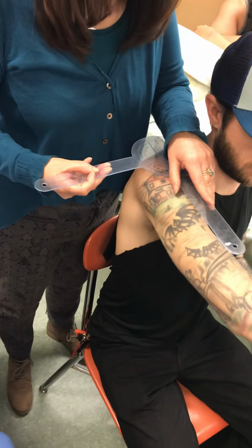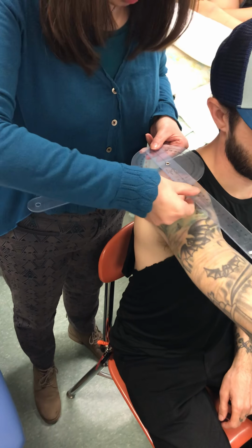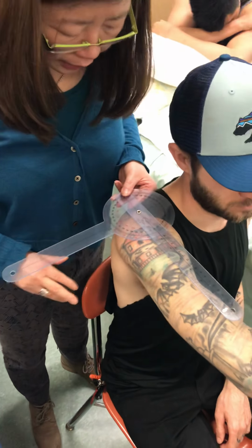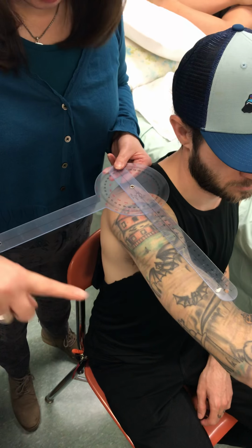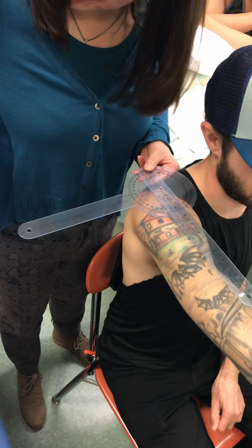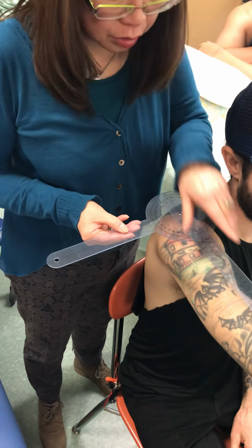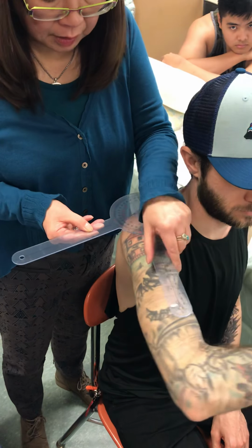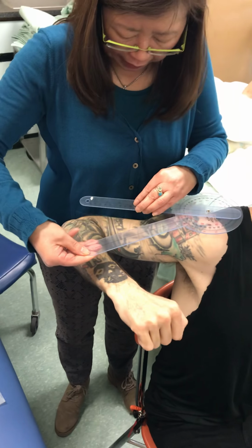Base of neck. Line everything up. Okay. Everybody can see that this is either 90 or 0, right? So when he reaches here, this is going to be 90, right? Goes further, it's going to be whatever you add on. Okay? So on the count of 3, can you bring your elbow back towards me as much as you can? 1, 2, 3. Good. Go, go, go. Switch my hands a little bit. Line everything back up.